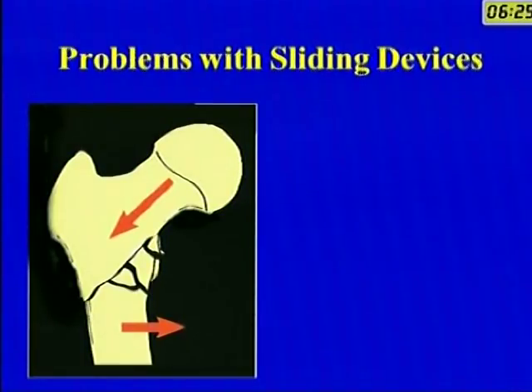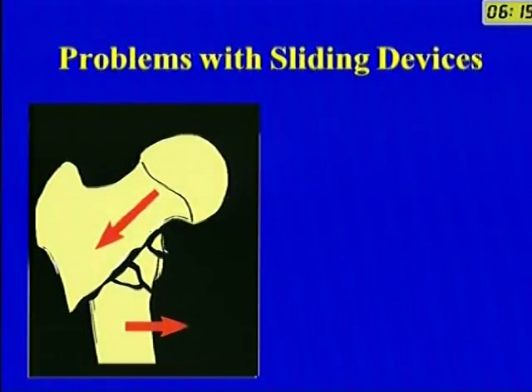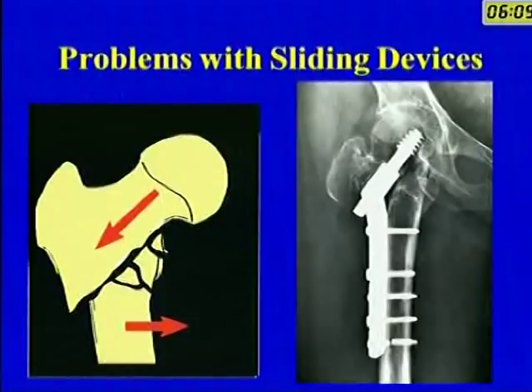But sliding devices do have a problem in certain kinds of fractures. One of them is this kind of reverse intertrochanteric fracture, where the proximal fragment can displace laterally, the distal fragment displaces medially, and you land up with a situation like that.